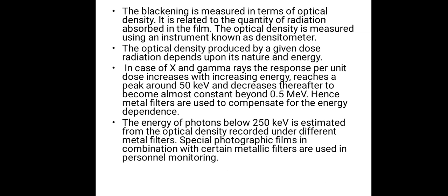The blackening is measured in terms of optical density. It is related to the quantity of radiation absorbed in the film. The optical density is measured using an instrument known as a densitometer. The optical density produced by a given dose of radiation depends upon its energy.